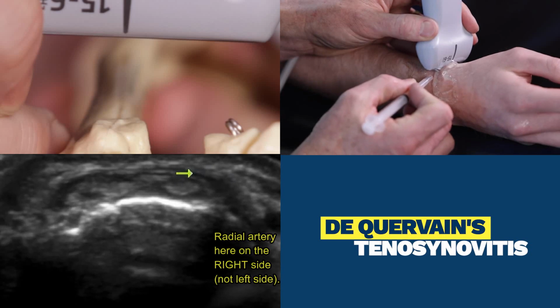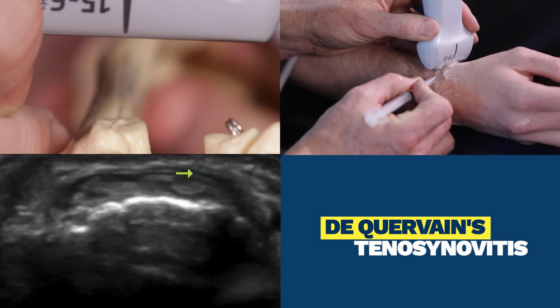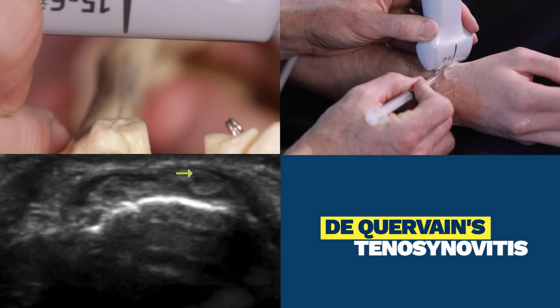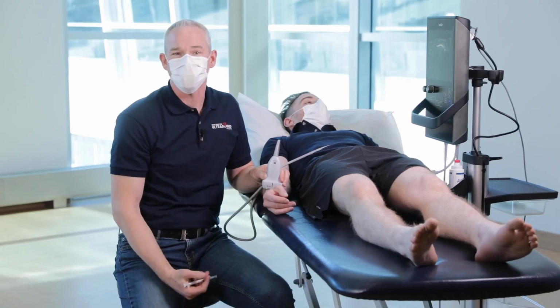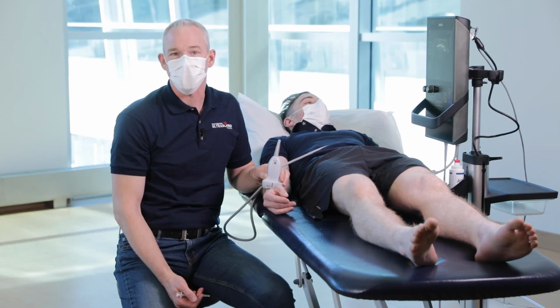Once again, the angle of needle entry would be like so, and the needle would land right where that yellow arrow tip is. So those are two different methods to find and inject the first extensor compartment of the wrist.